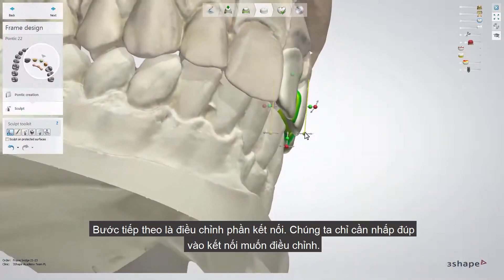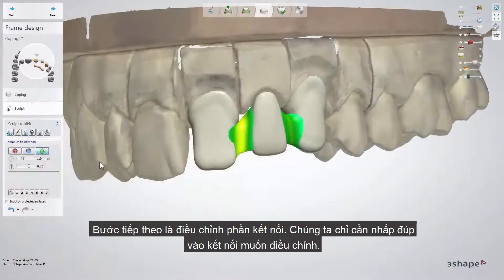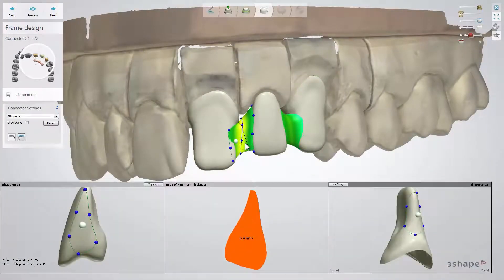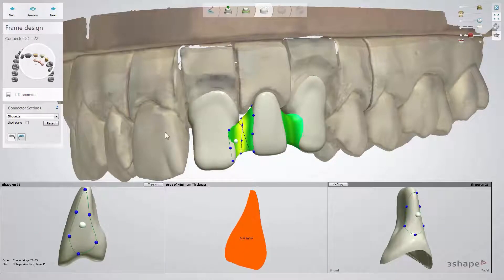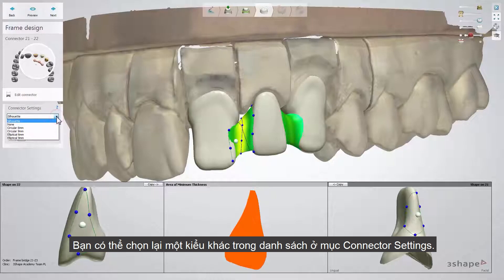When positions are set you can modify connectors. To do that, simply double click on one of them. Dental Designer automatically defines the shape of the connector which is set in the control panel. You can change it by selecting a new one using the drop-down menu list from connector settings in the edit connector sub-step.